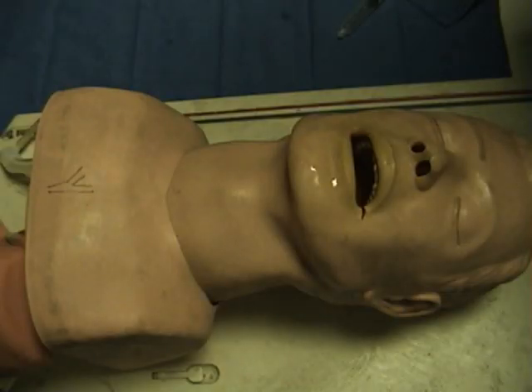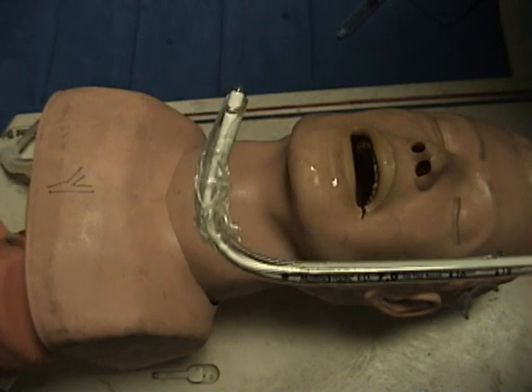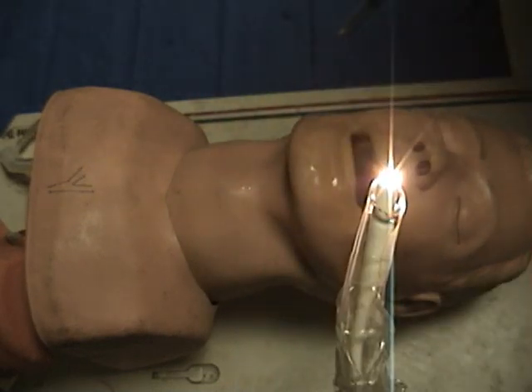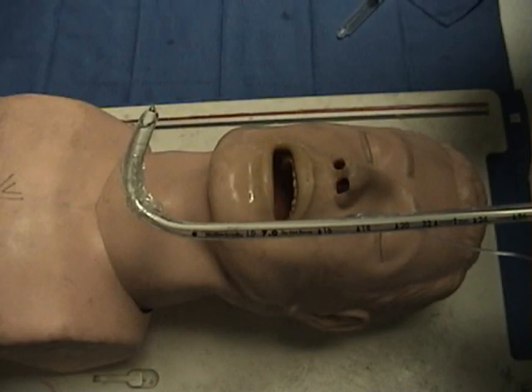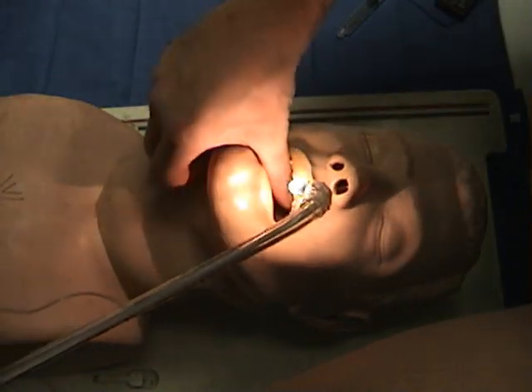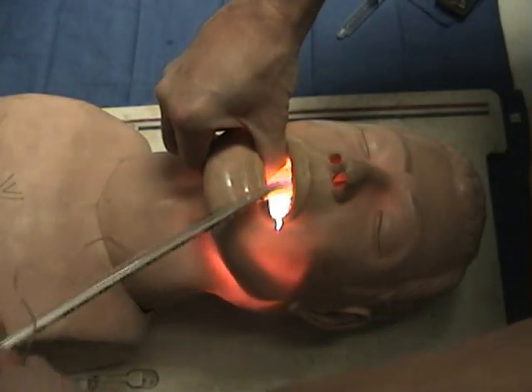Now that we are ready, we make sure that the room lights are dim and that the wand's light works properly. Using our non-dominant hand, we open the mouth with gentle pulling of the jaw to open the oropharyngeal and upper laryngeal inlet, and then place the stylet into the patient's mouth. It is usually easier to do it from the side of the mouth, which facilitates the entrance.